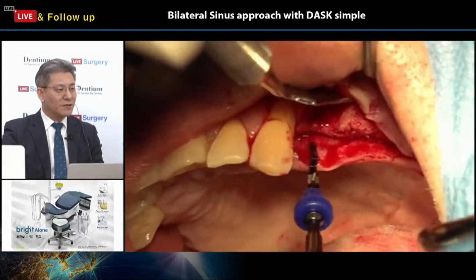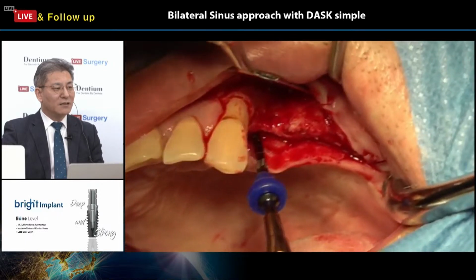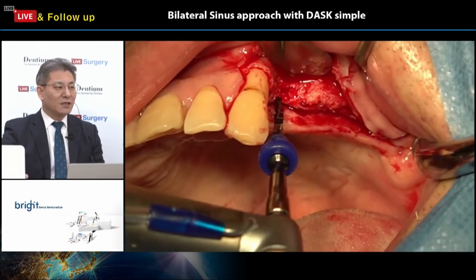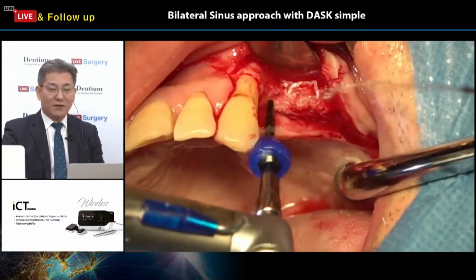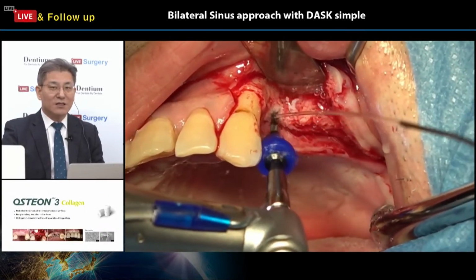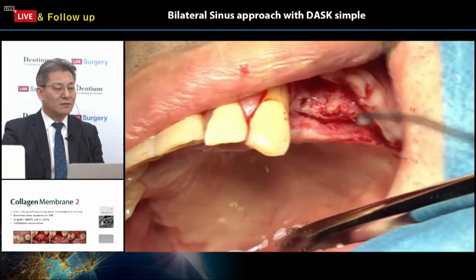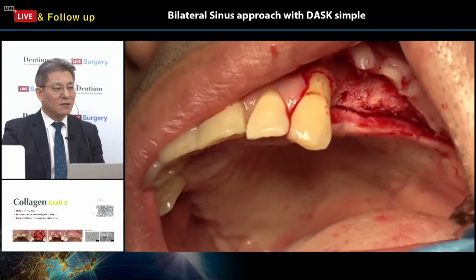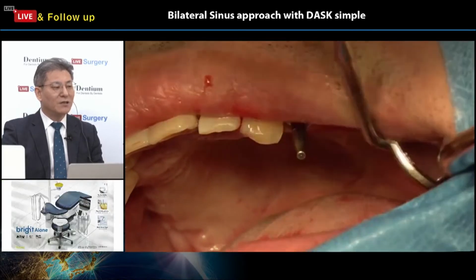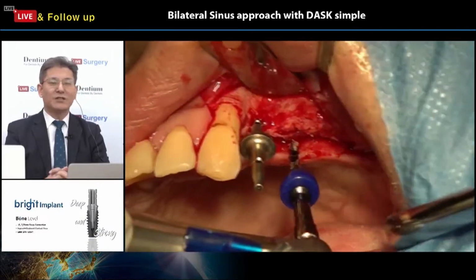Yeah, the Lindemann drill first, with the blue spacer connected to the Lindemann drill. This spacer is very useful and mandatory. It is a device for when you have freehand surgery, to get the proper insertion position for the initiation. Okay, Lindemann drill first here, and put the paralleling pin here. Dr. Chung is going to do a minimized GBR procedure.